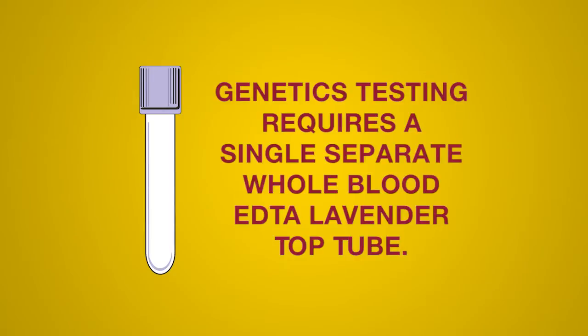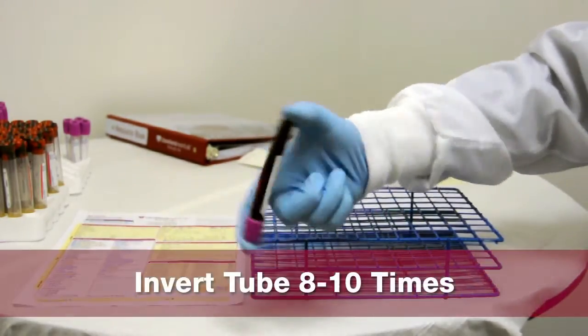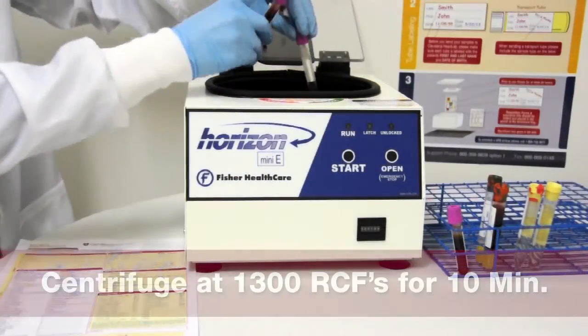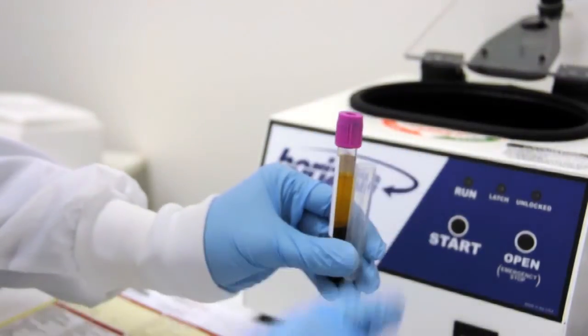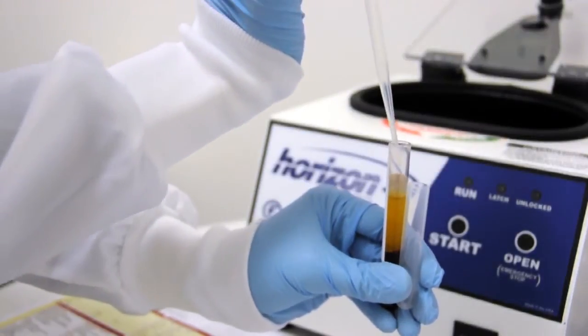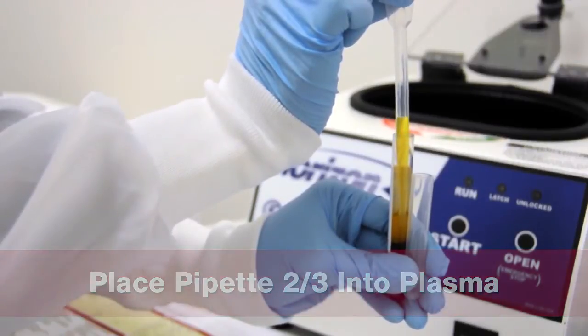Genetics testing requires a single separate whole blood EDTA lavender tube. Examples of genetic tests are ApoE, CYP2C19, and MTHFR. For an EDTA plasma sample, after gently inverting 8 to 10 times, immediately centrifuge at 1300 RCFs for 10 minutes. Once centrifuging is complete, open the tube, remove the plasma, the top layer, using a polypropylene transfer pipette. To do this, place the pipette 2/3 down into the plasma, making sure not to penetrate the red cell layer.